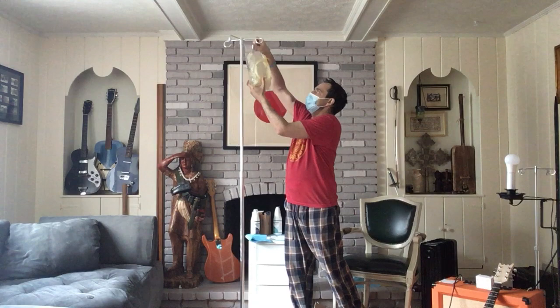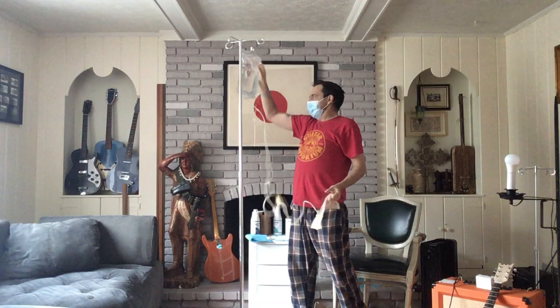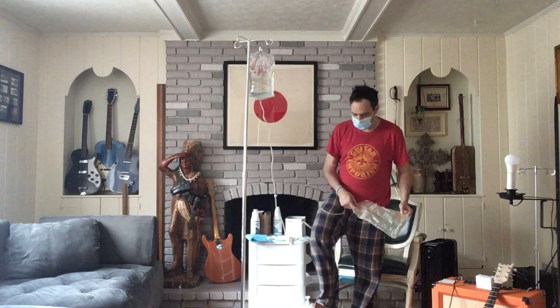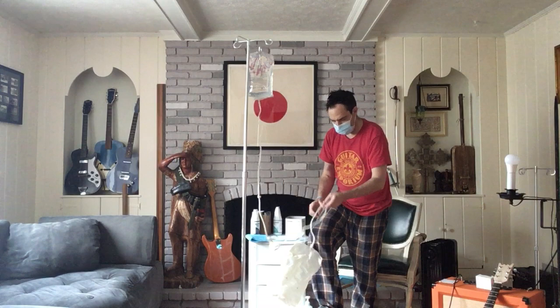Gravity is your friend in this situation. The higher the pole, the faster it goes into you. But first, you have to drain out what you have in you, which will come out in this bag, which should go on a flat surface. And you want to monitor the whole process to make sure there are no leaks.